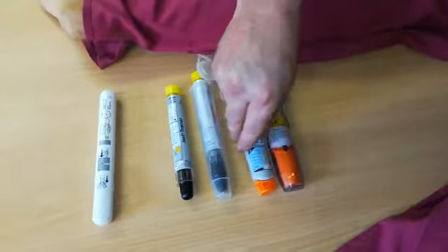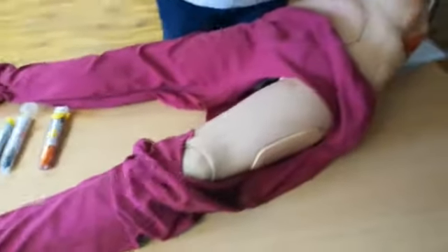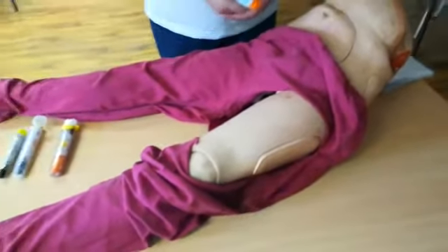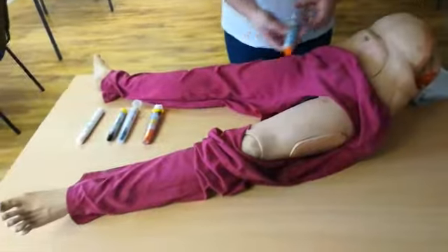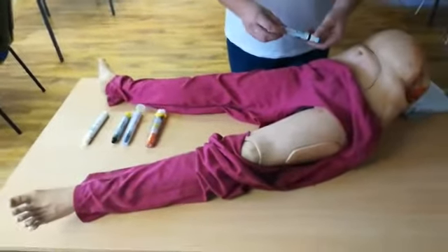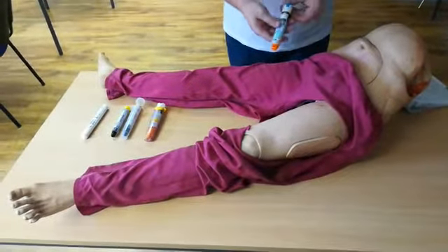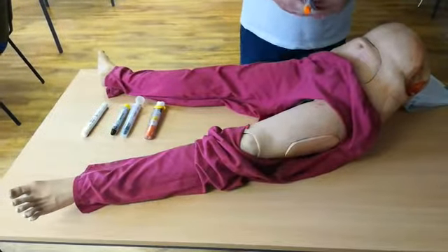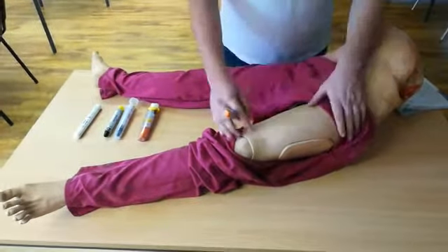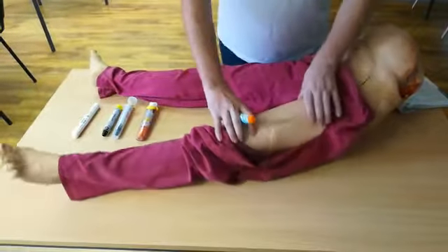When we are looking at our patient — somebody who has been diagnosed with anaphylaxis — the pen belongs to them. You're making sure it's in date, you're making sure you've got the correct dosage, either for a child or an adult. You then need to look at what you're identifying and where you're going to landmark.